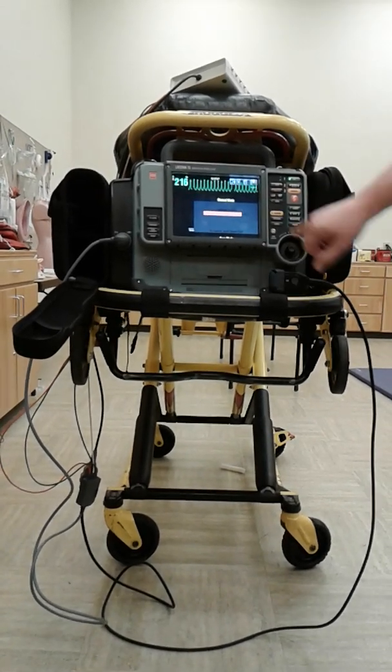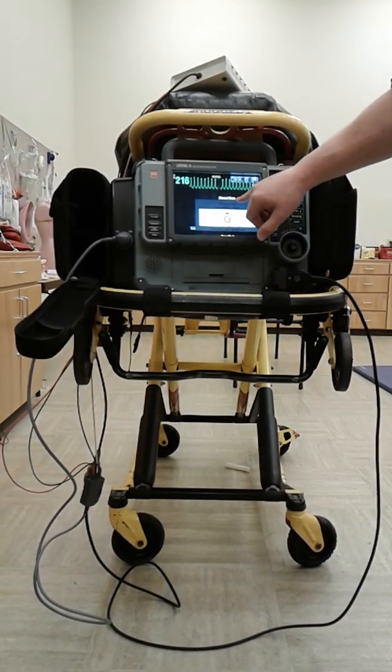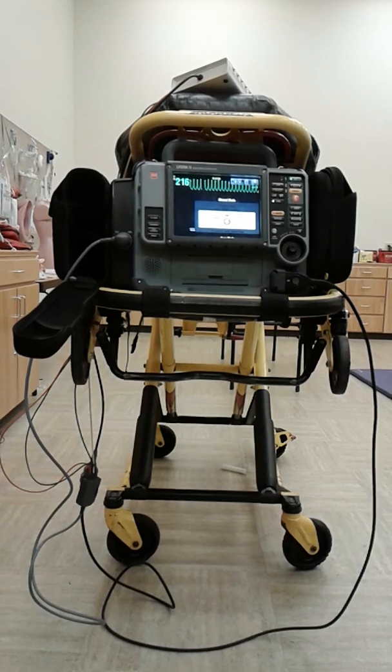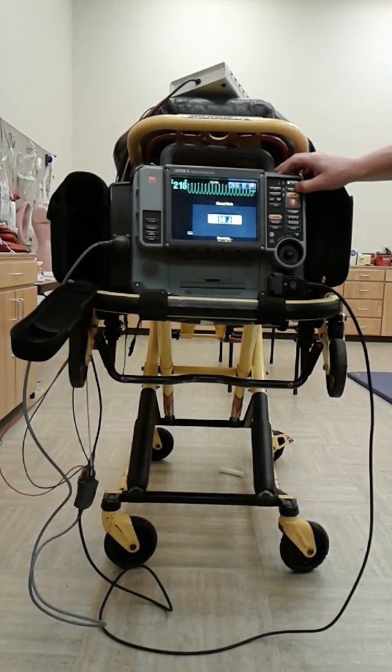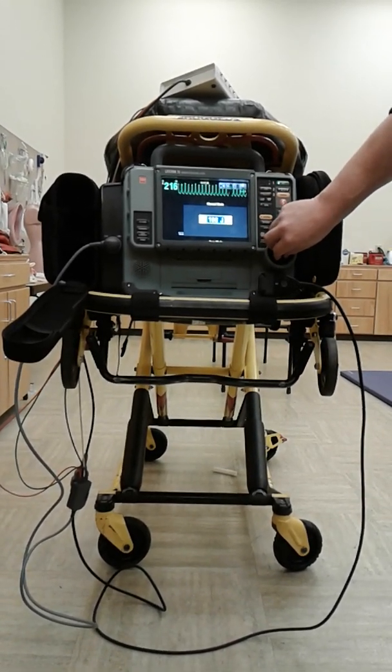When you hit charge, you want to make sure that it was charging at 50 joules, or whatever you set it at. Okay? If it does not, just reach up here and hit energy select again, and it goes back to that mode. So let's say, all right, I wanted 60 or 70.